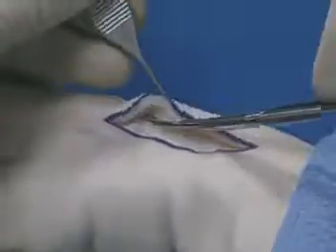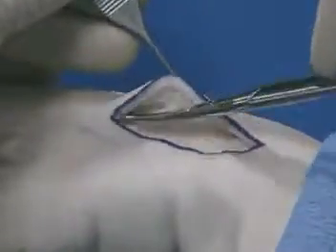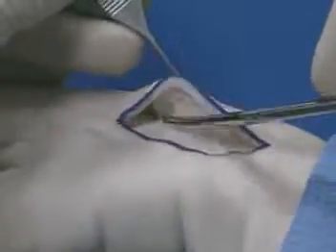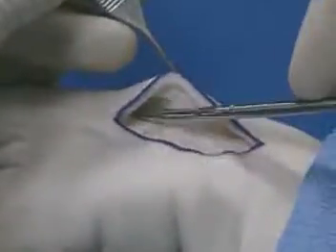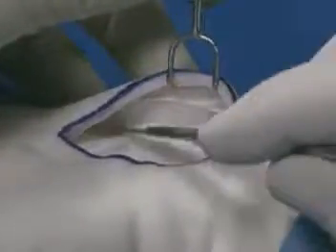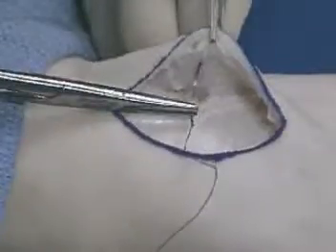When scissor dissection is used, the tips of the scissors are best kept tip upwards towards the skin edge so that the deep structures are not inadvertently cut. A number 15 blade can also be used to continue the undermining. This demonstrates that either a scissor or a number 15 blade can be used to undermine the soft tissues, which will allow closure without tension.